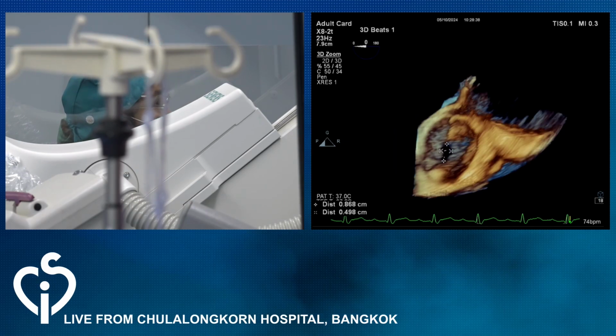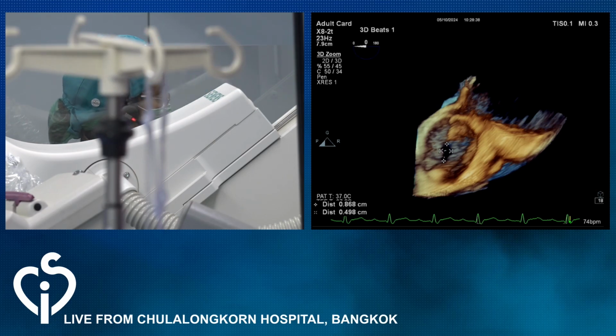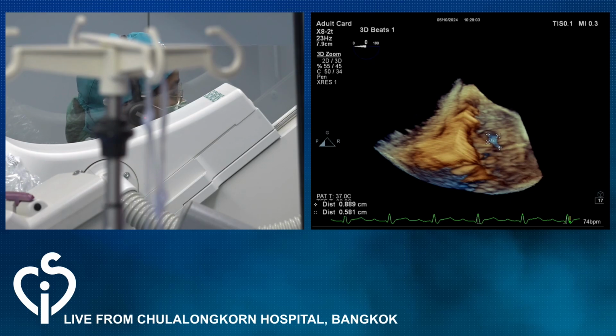And from the aorta perspective, the size is 8.7 by 4.9 millimeters. It's a little bit bigger than the angio. But also, there's 3D printing. From what I can see, there's no windsock appearance. Is there? Nothing flopping around.